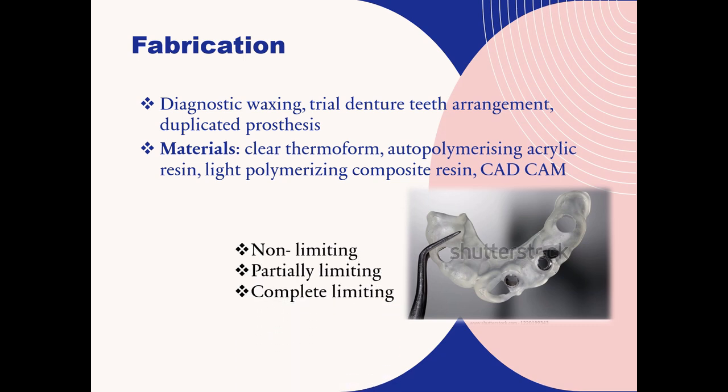And based on the amount of surgical restriction, there are three types of surgical template design. That is a non-limiting, partially limiting, and completely limiting design. Now let us see one by one.